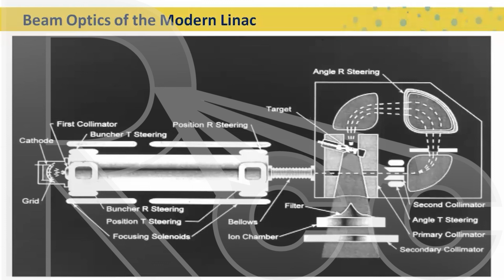So in the calibration protocols that I follow, the chamber is always referenced to cobalt, and then factors are applied to that. There are different factors that are applied to your cobalt factor to correct it for the linear accelerator energy that you're using. But as far as the standard instrument, the Farmer chamber, the dosimeter that you use to measure the beam, it's referenced to cobalt and it's referenced to water. So it's not referenced to plastic. It's not referenced to polystyrene. It's not referenced to any of the plastics that are out there. It's not even referenced to solid water. It is referenced to liquid, fresh water.